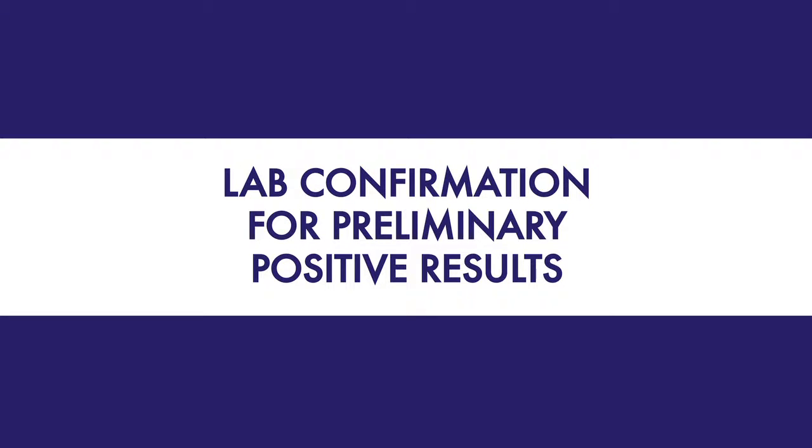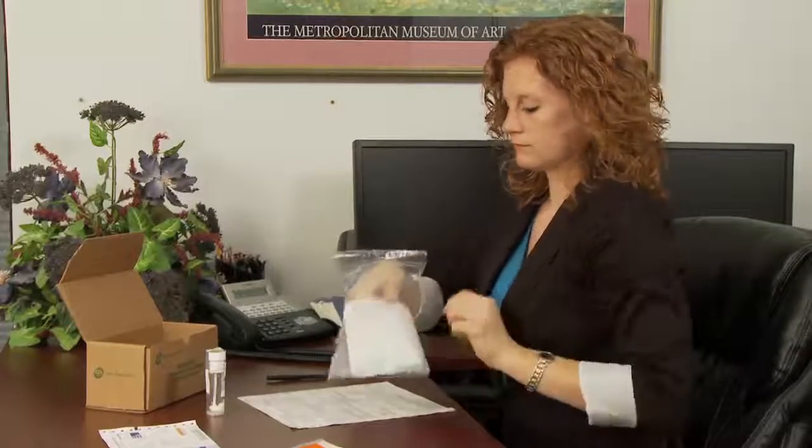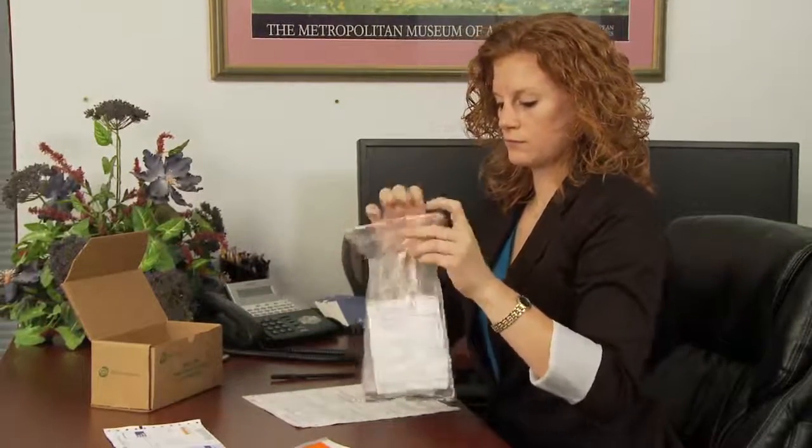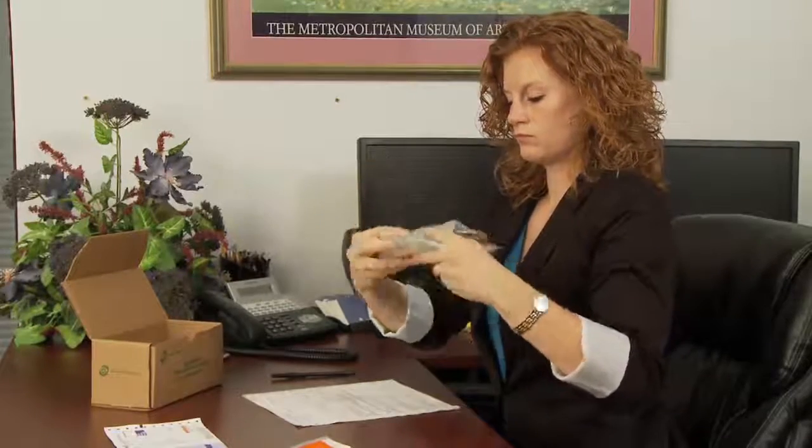After completing the preliminary result form, the preliminary positive sample should be sent to a laboratory for confirmation. Procedures will vary depending upon the lab of your choice. Consult with your lab or service provider regarding chain of custody forms, security seals, shipping supplies, and additional training.